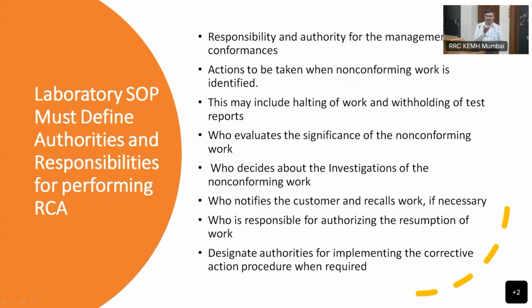Most of the times, I'm one of the good member of a good WhatsApp group actually. उसमें लिखा था our senior biochemist actually. ये हर बार क्या होता है कि IQC we are running. First IQC run is always out. Okay. और rerun करते हैं तभी ना. Correct. It's common scenario. Correct ना sir. So very common scenario. दूसरा QC है बराबर ही ना जाता है.